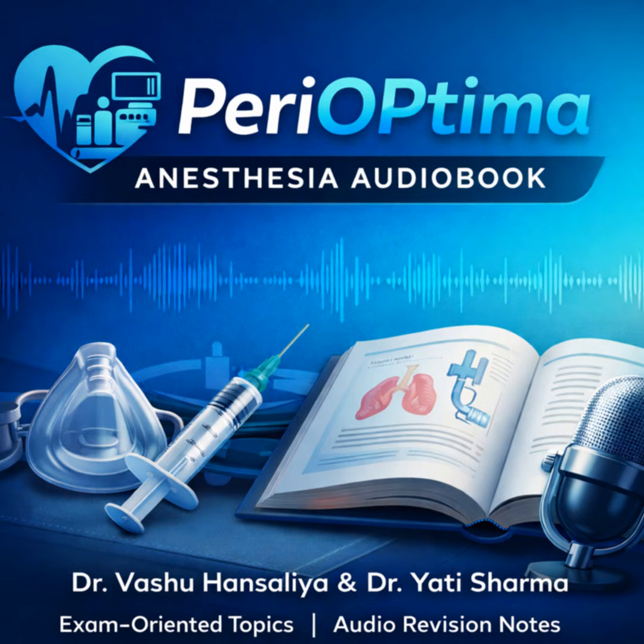Of course, we have to talk about the other side of the coin. The limitations and challenges of VL. Right. They're not a silver bullet. They still require some degree of mouth opening, so a patient with severe trismus is still a major problem. They also don't have the same versatility as a flexible fiber optic scope. You can't go through the nose. Can't go through the nose, can't go through a tracheostomy, can't use them to check a double lumen tube's position, or for suctioning the lungs.